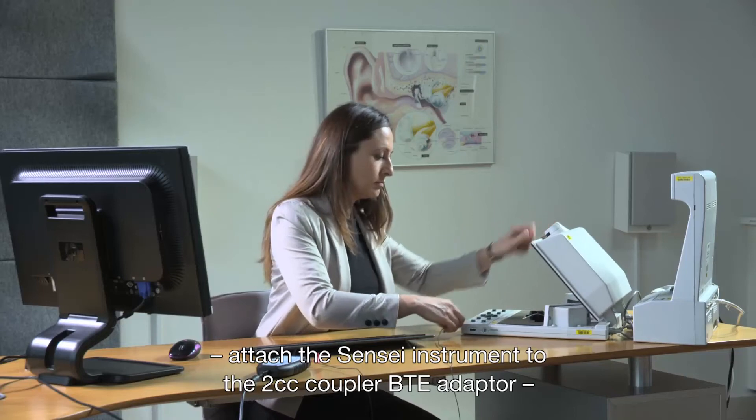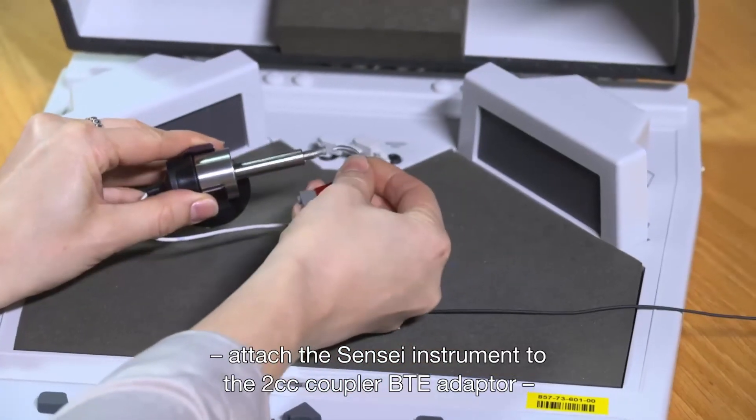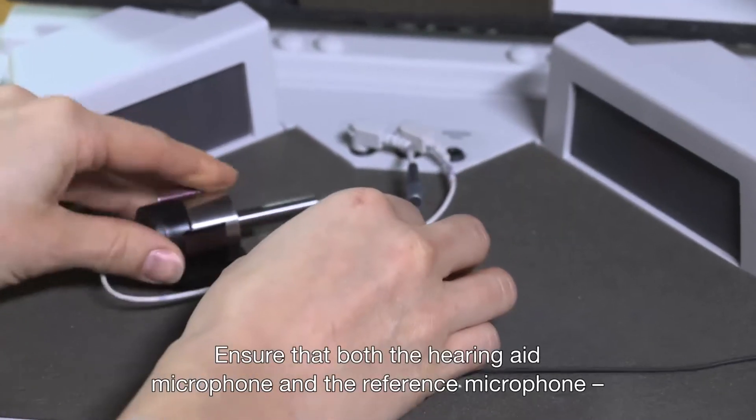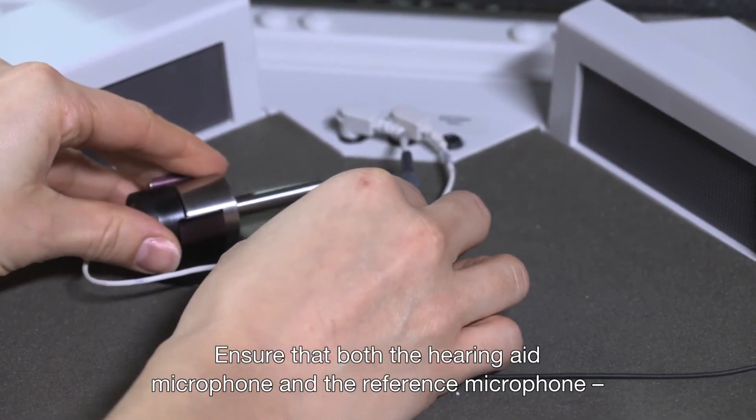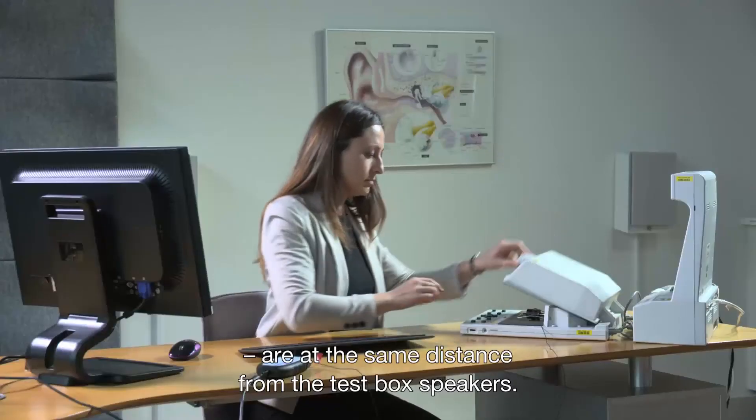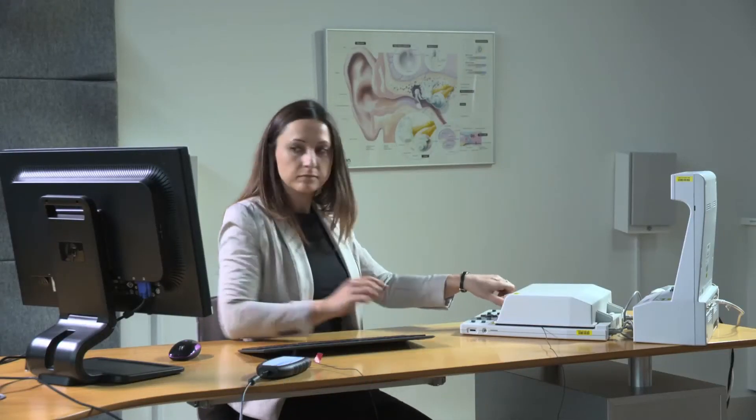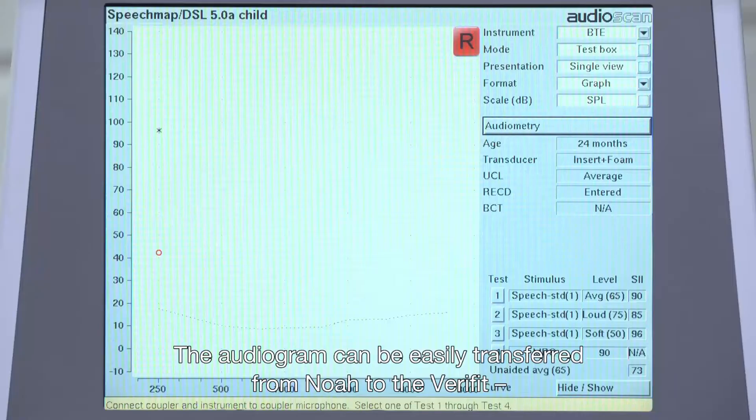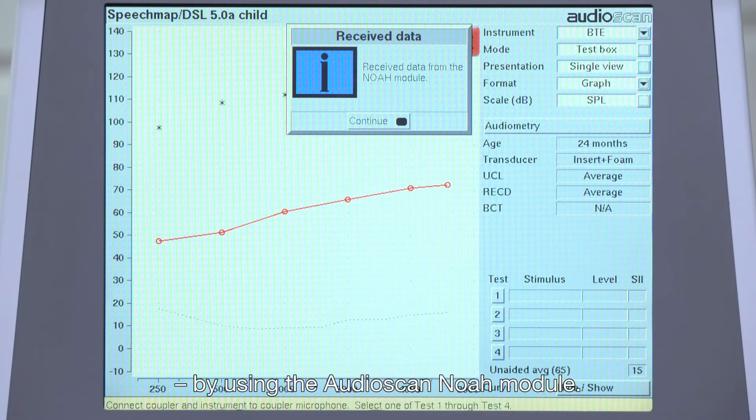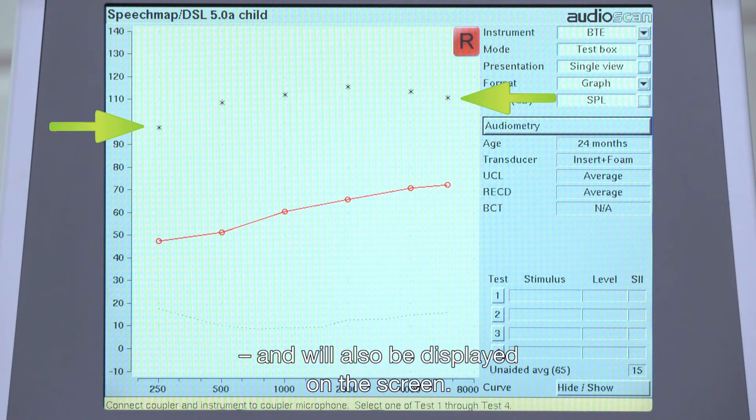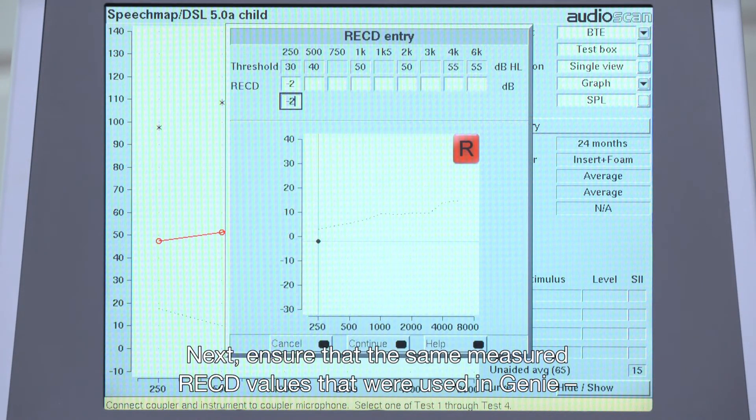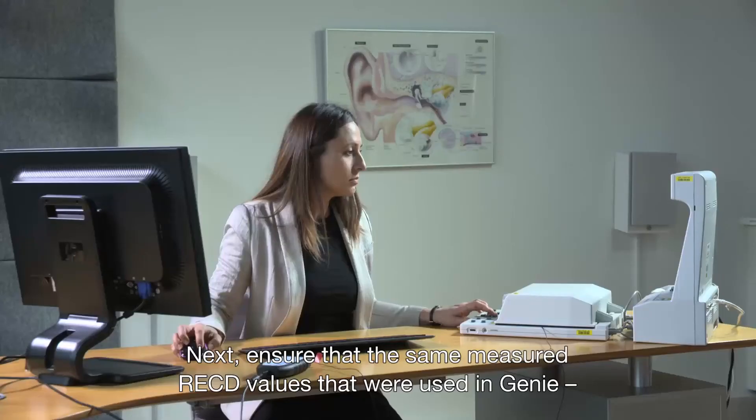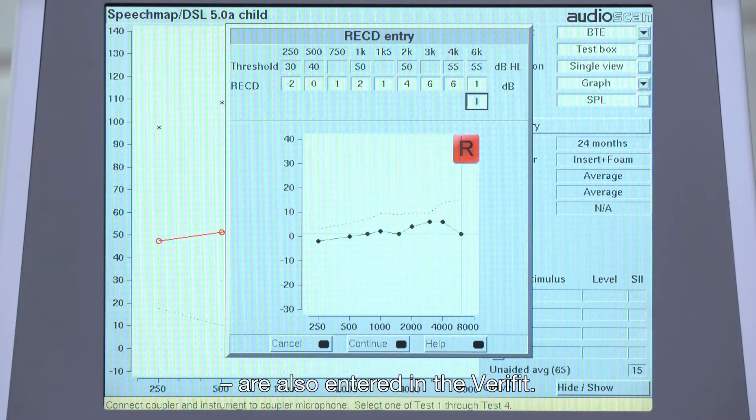To prepare for the coupler-based verification, attach the Sensei instrument to the 2cc coupler BTE adapter and position it in the test box. Ensure that both the hearing aid microphone and the reference microphone are at the same distance from the test box speakers. The audiogram can be easily transferred from Noah to the Verifit by using the Audioscan Noah module.